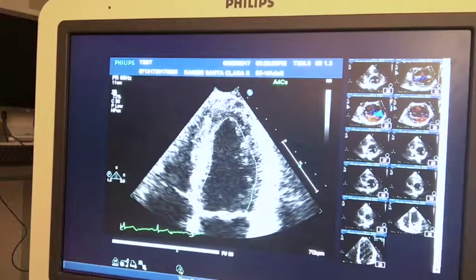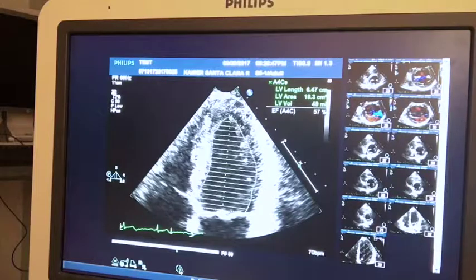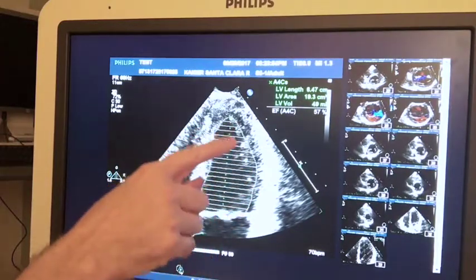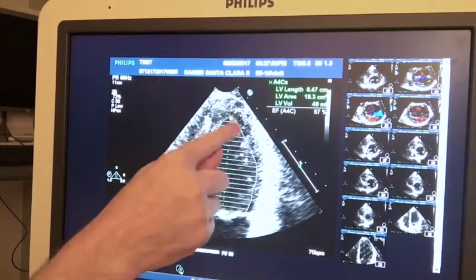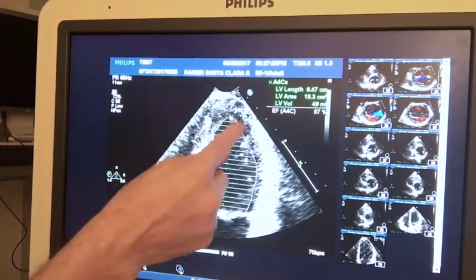And I come around, and the thing is to be consistent. So if you're going to cut off all of the trabecula in the left ventricle, consistently do that across the board unless your cardiologist is instructing you to do something different. If you're consistently going to not measure these trabecula or these parts of the papillary muscle and things like that, make sure that you are tracing consistently, and then you can be advised by your own cardiologist or your own group that you're working with where you want to put the border of the endocardium.